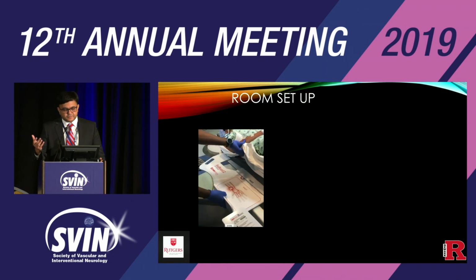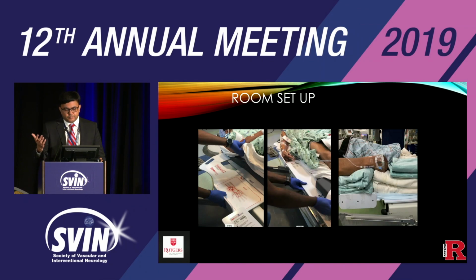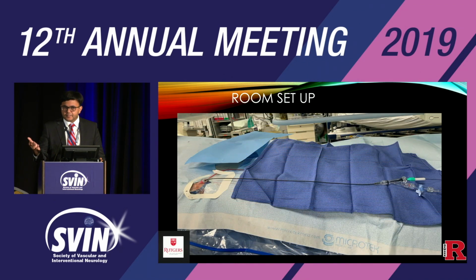So this is the room setup we do. If you have a Merit board, you can place it. We use an extender also. And then we put a bunch of cushions across it to make it to the level of the groin. And then in the end, it looks exactly like the groin. It doesn't feel different, as if you're doing something different when you're puncturing a radial artery. And also, if you see, we prep the femoral as a backup, and we just create a hole in the drape and then put the sheath through it.